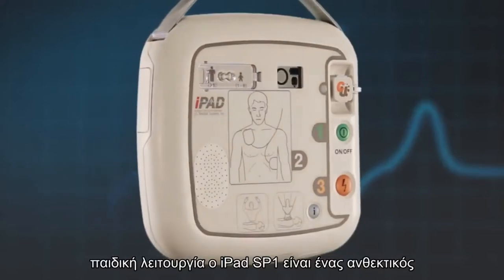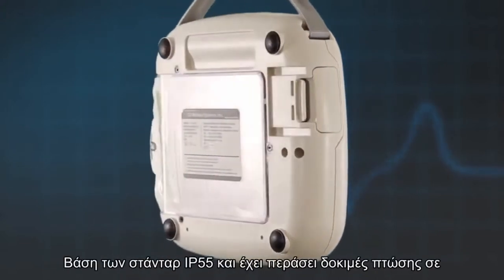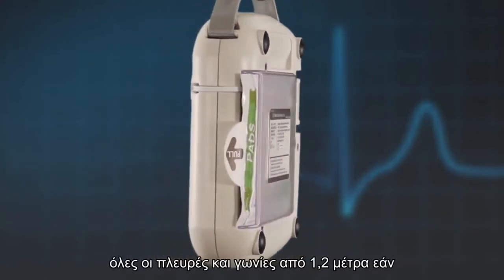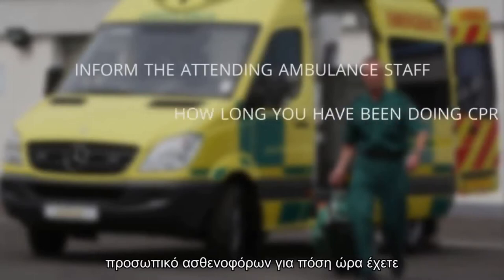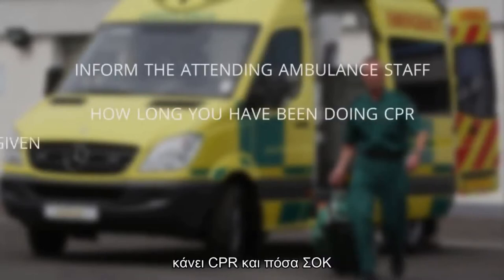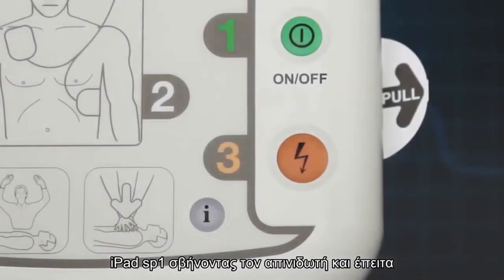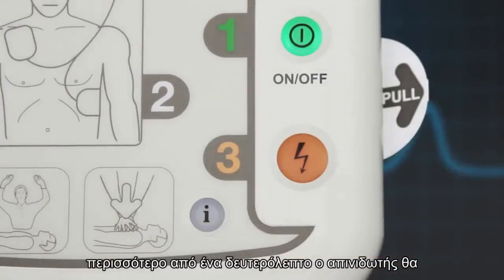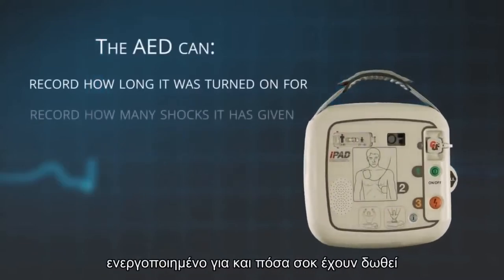The iPad SP1 AED is a robust AED that holds a water resistance rating of IP55, and it has passed drop tests to all sides and corners from 1.2 metres. If you have to use your AED, it is always important to inform the attending ambulance staff of how long you have been doing CPR and how many shocks you have given. This is easily done by turning the AED off and then holding down the blue I button for more than one second. The AED will immediately tell you how long it was turned on for and how many shocks it has given.